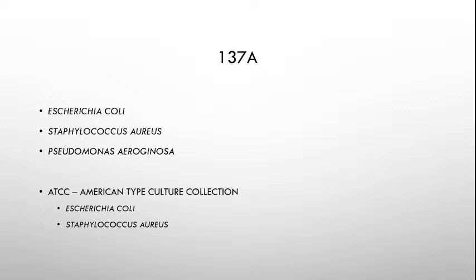Okay? So it has to follow compliance certification, and the manufacturer also has to follow compliance certifications, whether it be ISO, whether it's College of American Pathologists, it doesn't matter. As long as it's certified and it has been genetically determined. Everything needs to be genetically determined because otherwise, your controls aren't really controls. They are just experiments. Okay? So that's the difference between a quality control procedure and an experiment. You don't necessarily know everything.